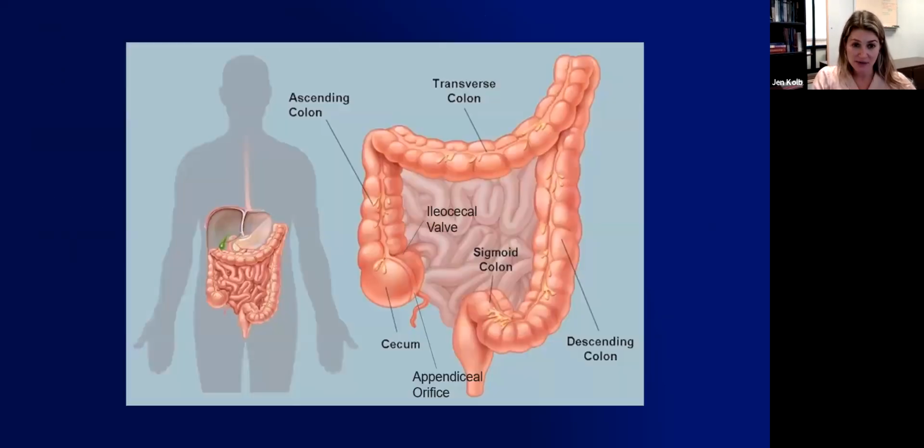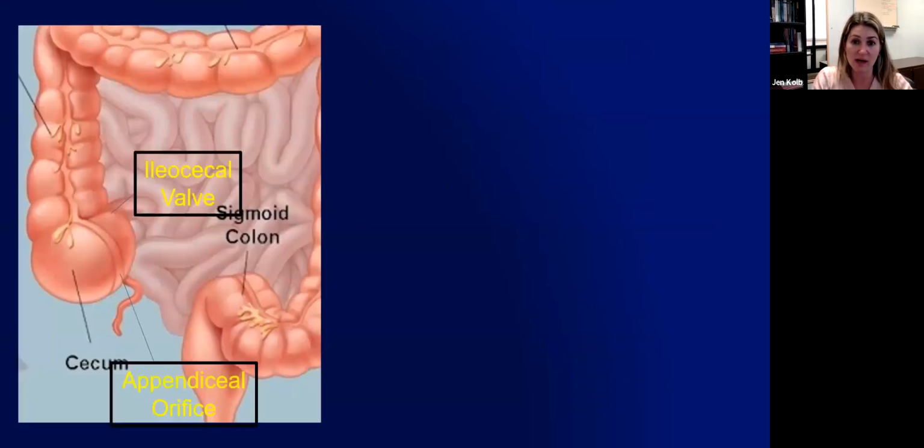And so again, if we think about this orientation, then talking about how do you know was the procedure complete? Technically they should tell you in the report, but if you have to be a detective and do some digging, I want to give you a few tips of how you might read between the lines.